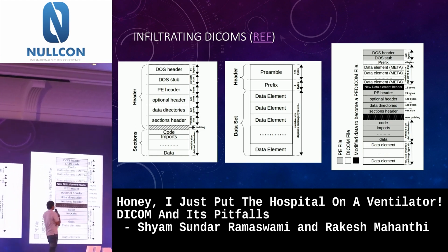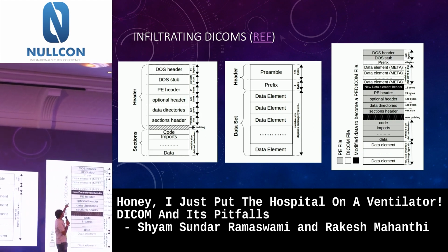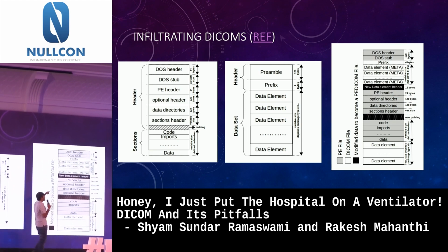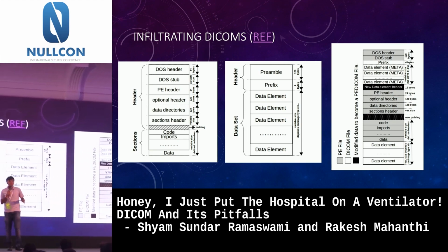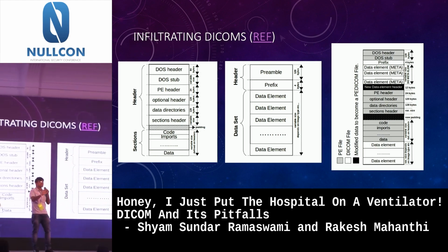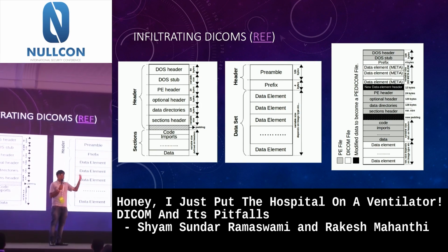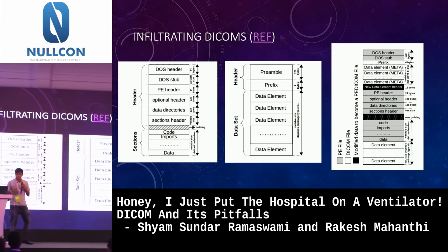Right? And post that, there are certain things which need to be done. The size of the PE header has increased because there are certain data elements which are above the private tag. So we need to update the length of the file header and point it to the raw data, file alignment. Most of you know what file alignment is, right? So exes have to be broken into certain sizes in order to go into the paging memory. So all those things have to be updated at byte level. All that is being done by the script which I have written.